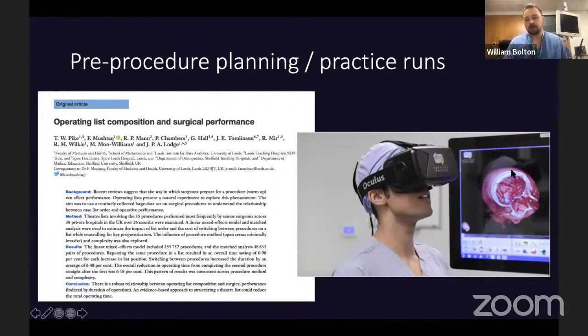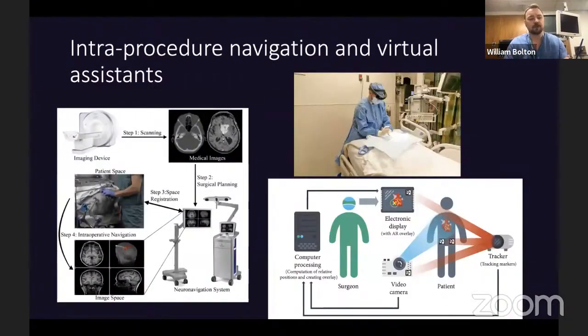This is a neurosurgeon doing some preoperative planning on a tumor case, and they're visualizing the anatomy and the relationship with the critical structures, so that when they actually get in there, they know how much bone do I have to take off, or how deep do I have to go, or what's the relationship to that structure, how safe am I there. Most interventionists would go through it in their head anyway. They'd look at the scans, they might sit there the night before figuring it out. So we do this anyway, but it's how do we provide extra information and maybe make that even more efficient with XR? I'm just conscious of the time.